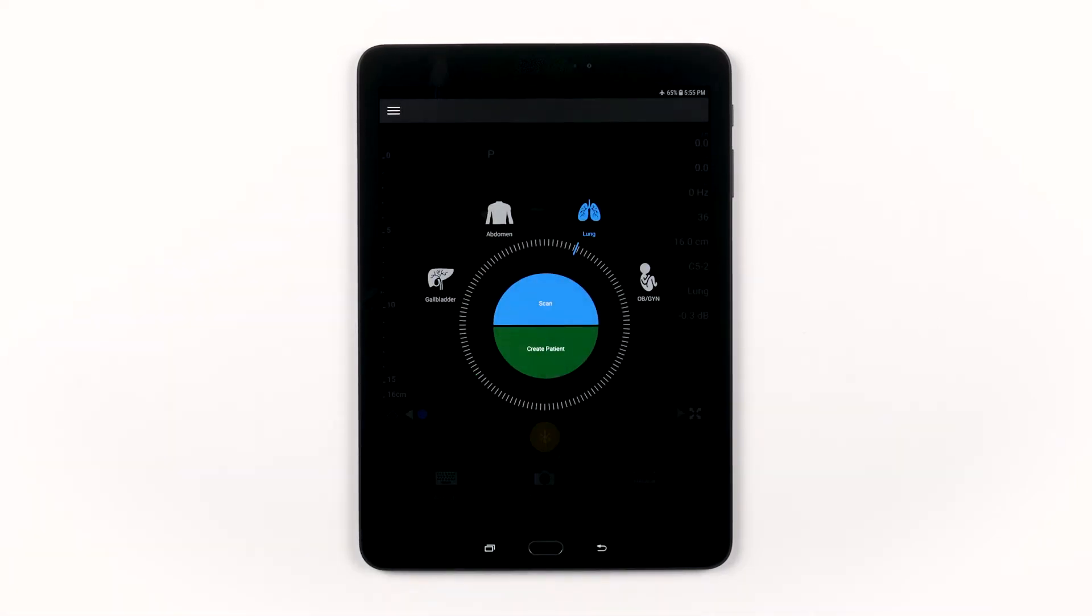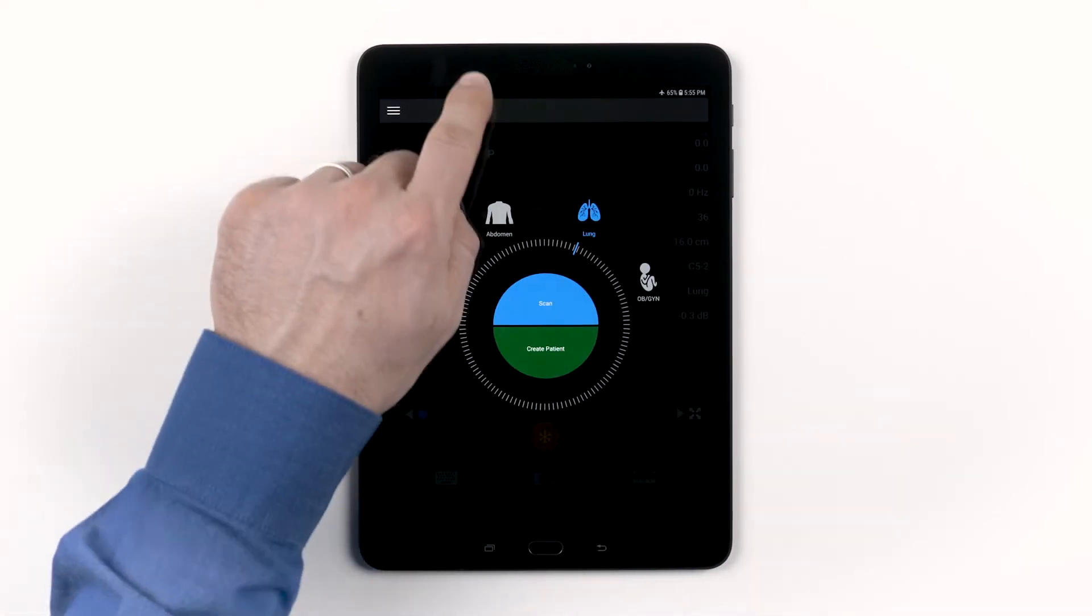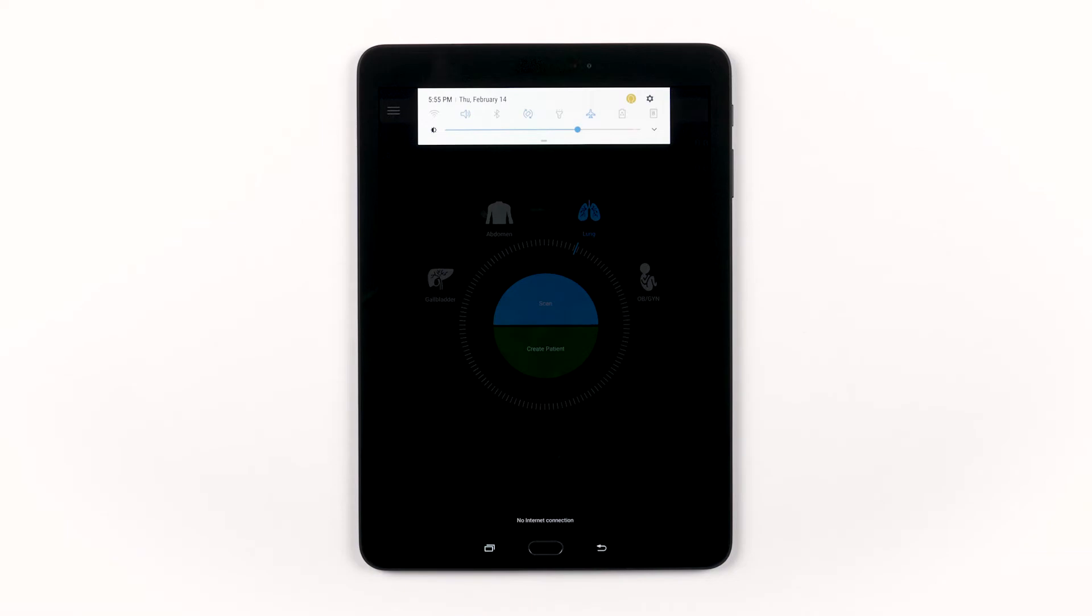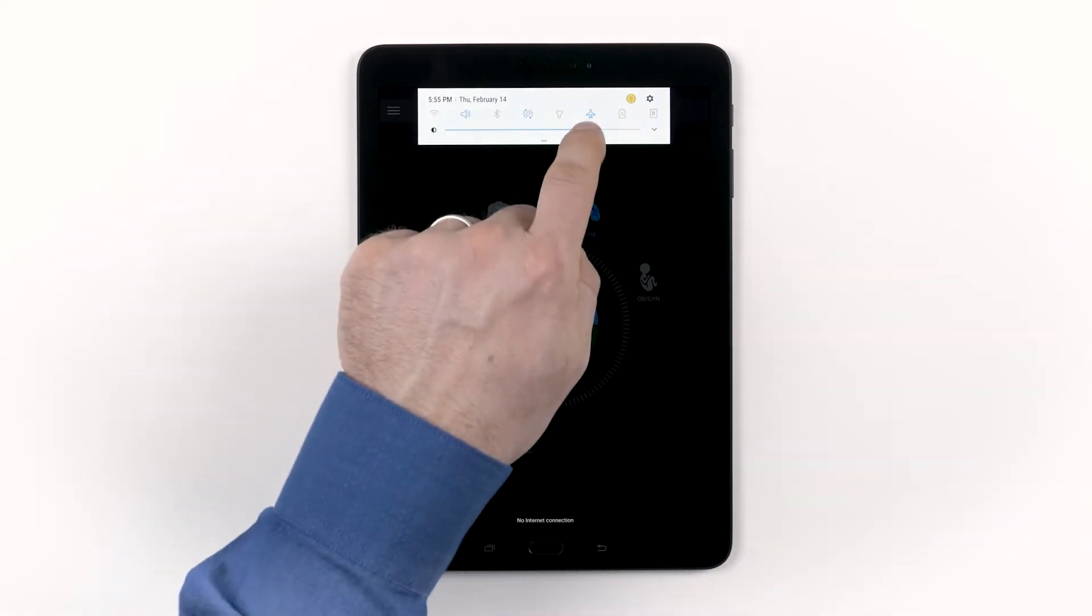To get the brightest colors and the clearest images on your device, adjust the brightness of your display all the way up.